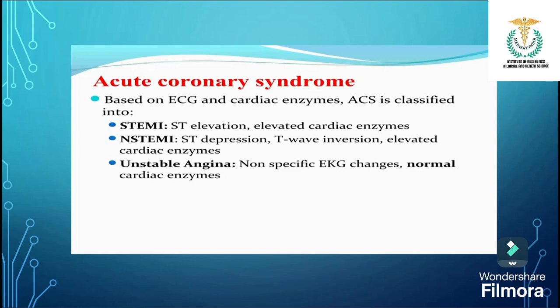So that is STEMI. And what is NSTEMI? ST depression, that is non-ST elevation MI. In NSTEMI, you will see ST depression, T wave inversion, and elevated cardiac enzymes.